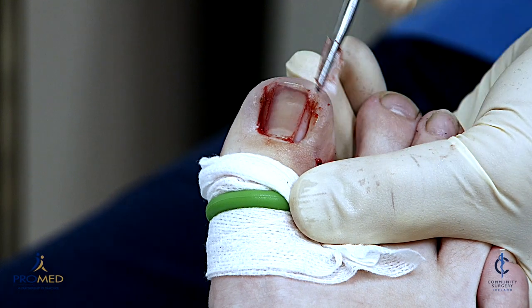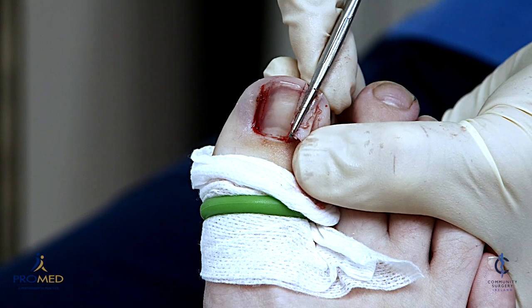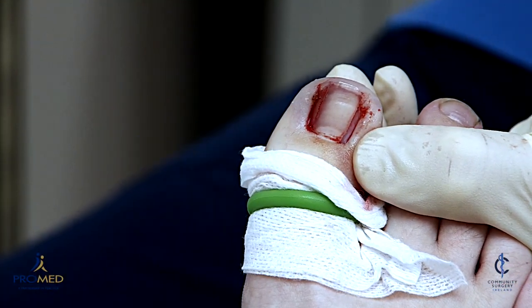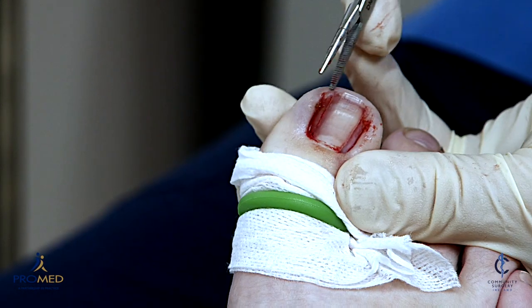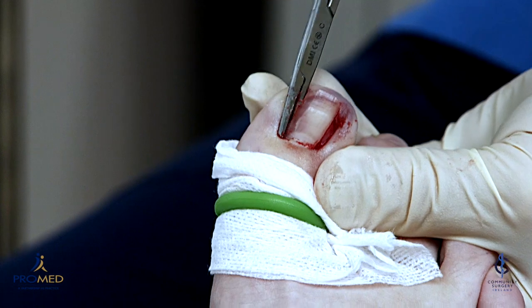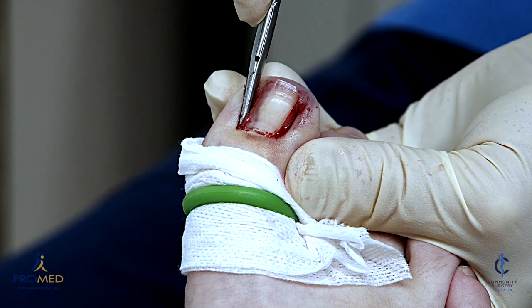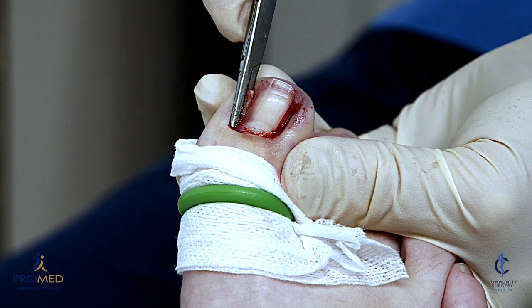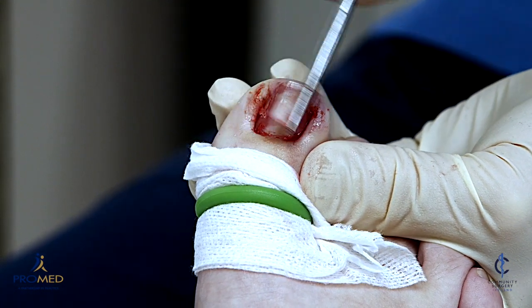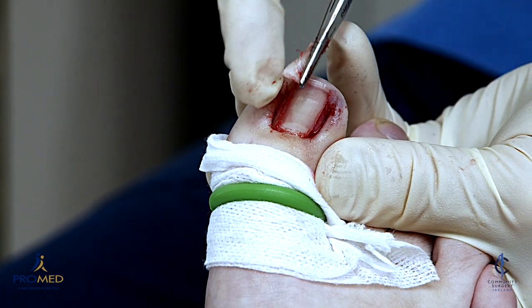You can see that pretty much the whole corner of the nail has come out. It's a nice feathery edge at a nice angle — we've got it all out. If you leave a little bit behind, it could grow back as a spicule, which isn't serious but is uncomfortable for the patient. We can also take away some of the granulation tissue and then take out this bit of the nail.